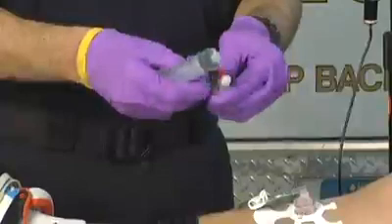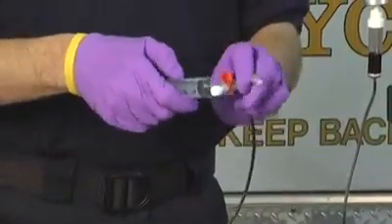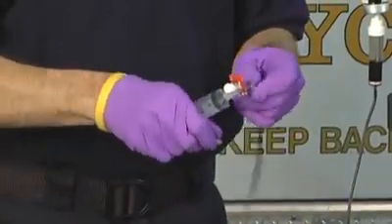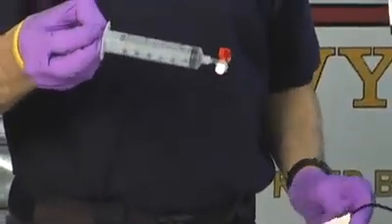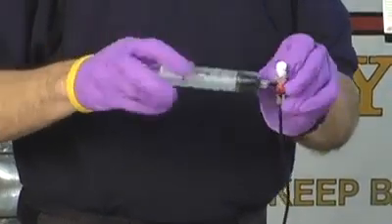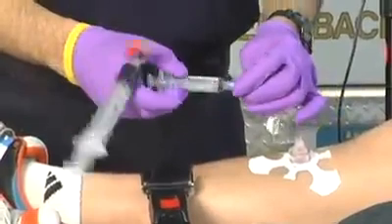You could use a 30 cc, a 20 cc, or a 60 cc — you just need a big syringe. So we're connecting that to the stopcock. We're now going to connect the medication to one piece of the stopcock, and then connect the other end to the intraosseous line once we've pulled some of the medication into the syringe. We'll pull some of the medication into the syringe and load it up, so now we have the medication to the tip of the stopcock and we're ready to attach it to the intraosseous line.